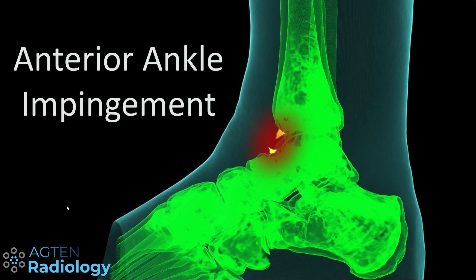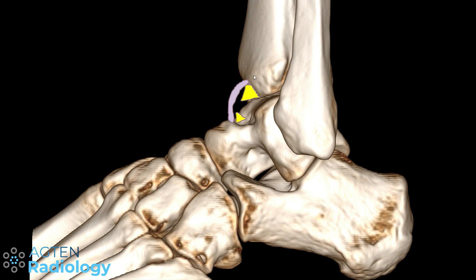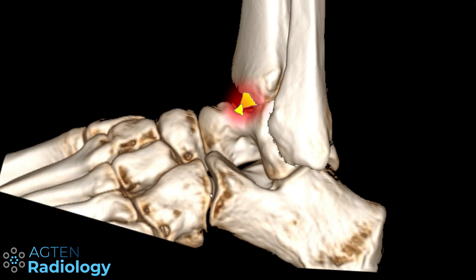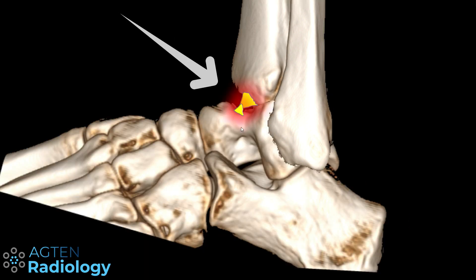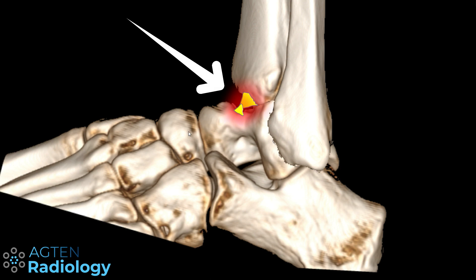Focusing on anterior ankle impingement, you normally have bony spurs or osteophytes at the anterior side of the ankle joint. One important finding is that they lie intra-articularly rather than where the joint capsule inserts. These bony spurs limit your dorsal extension of the foot — your range of motion is limited because bony structures are impinging each other and the soft tissue in between. You get irritation, bone marrow edema, soft tissue edema, and pain. It is important to realize that this is actually a clinical diagnosis and not one we can make on MRI alone.